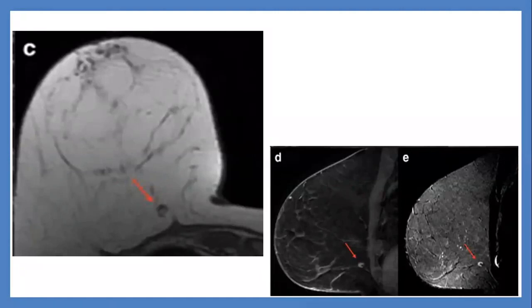Okay. What else? What other characteristics? Uniform cortical thickness. What else? More characteristics. On MRI the characteristics will be more. Near the vessels. What about T2 signal? What about post contrast? You still have more characteristics.